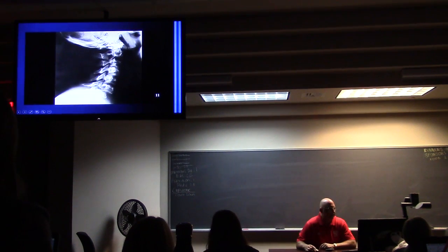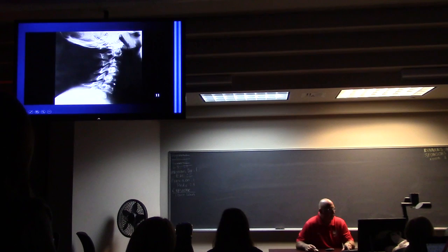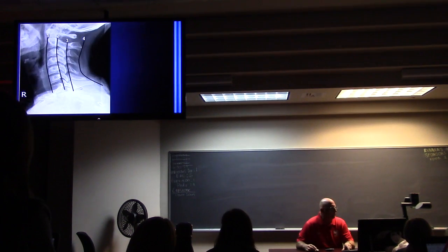We shot it again to see 7. That should hammer home why you've got to see C7. This is a 6-on-7 fracture. Subluxation. So you can see now the anterior vertebral line jacked up, posterior vertebral line jacked up, spinal laminar line, you can't really see that.